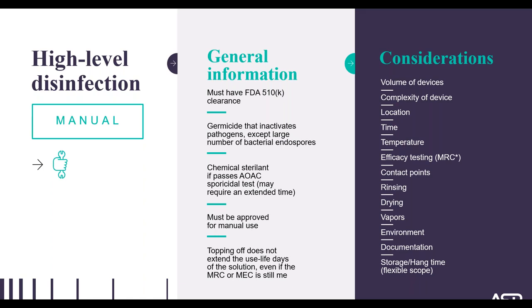Do you have a way to monitor the time and temperature of the high-level disinfectant? How is the high-level disinfectant going to be tested for efficacy? Will test strips be used, or will it be an automated system? Will the rinsing of the device be done properly? Is there the space and setup to do it? Is the manufacturer requiring a sterile water rinse? Manual documentation will need to be performed. Can you capture and ensure that it's done correctly every time?